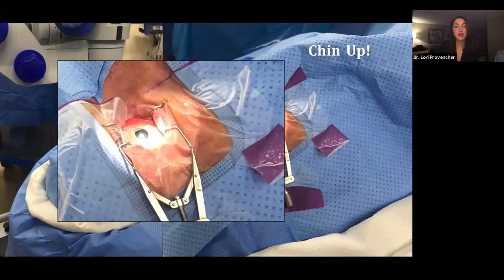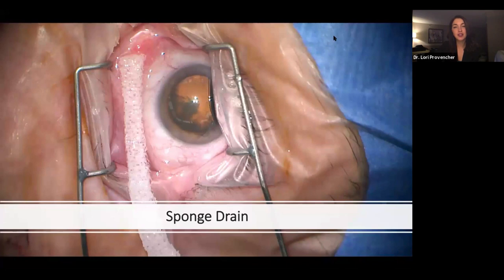By the same fashion, you can tilt the bed backwards a little bit to expose the superior globe and to get the brow out of your way a little bit. This is something I didn't learn until fellowship, and I thought it was just so genius. But you get that pool of BSS during FACO, and it can really distort your view. So if you have an instrument wipe, you can cut just a little strip off the side and stick it in the fornix.